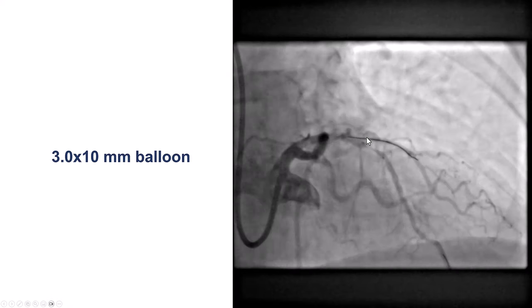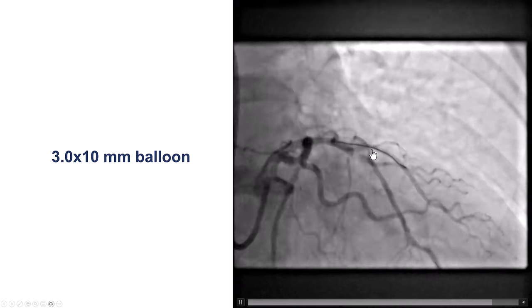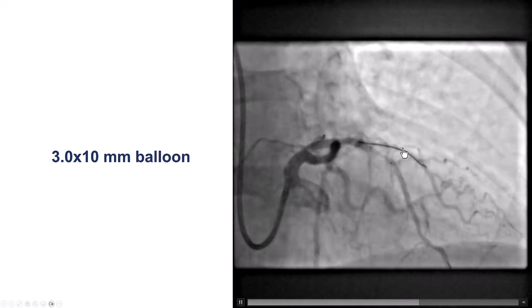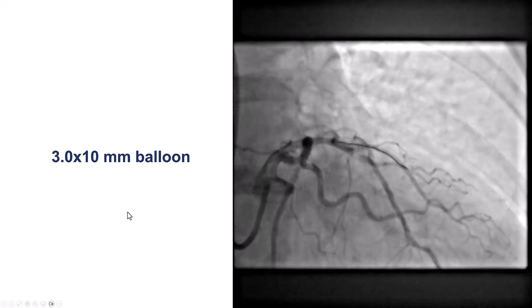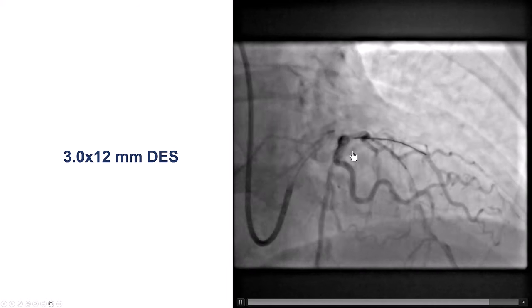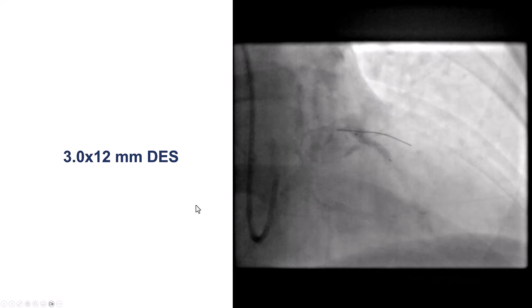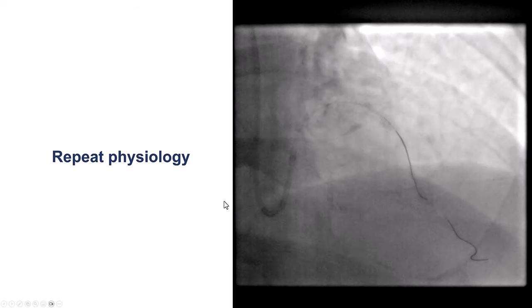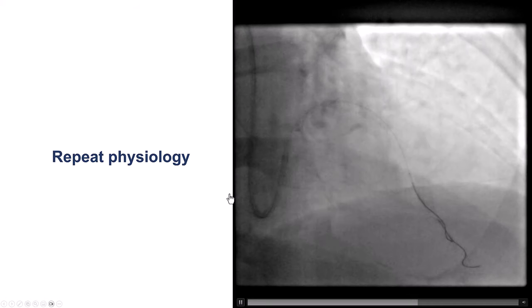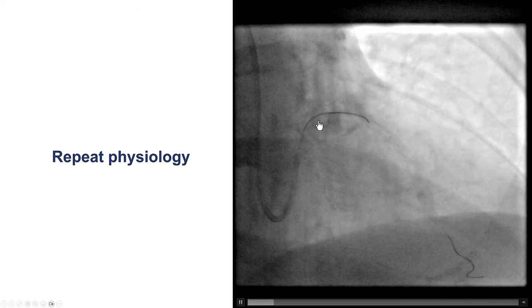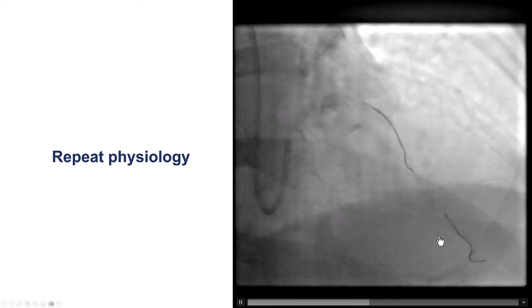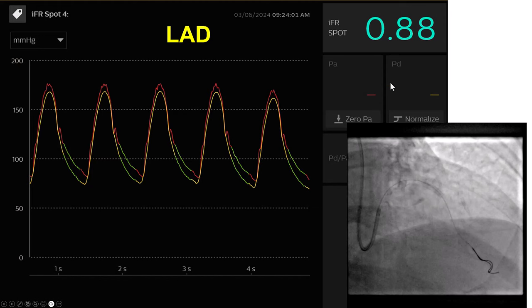So it was fairly clear-cut. We pre-dilated with a 3.0 mm balloon. We used a wire in the diagonal to mark it and protect it in case the stent came back too proximal. We placed a 3.0 by 12 mm drug-eluting stent, which expanded fairly well. We then advanced the pressure wire through the stent to the distal LAD and did a repeat measurement — and we were surprised to find the IFR had not significantly improved: it went from 0.85 to only 0.88.